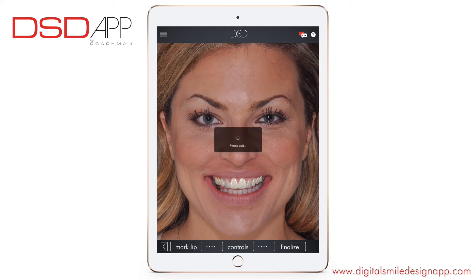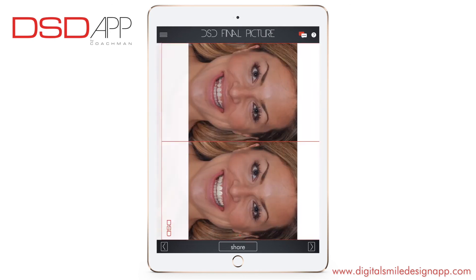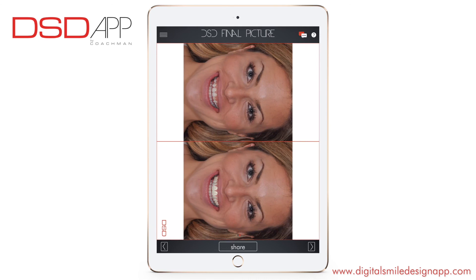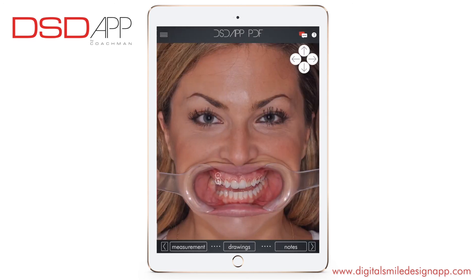Finalize your smile design. Using the slider, you can show before and after. Swiping through the screen, you will see the side-by-side result. Share on Facebook, Instagram, email, or Twitter. Go to the next screen.